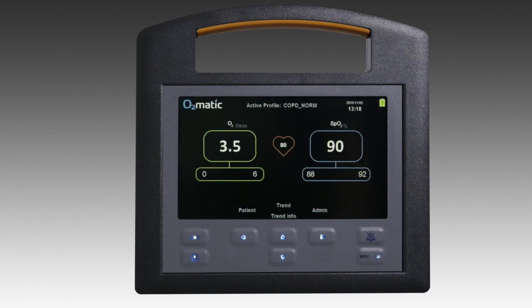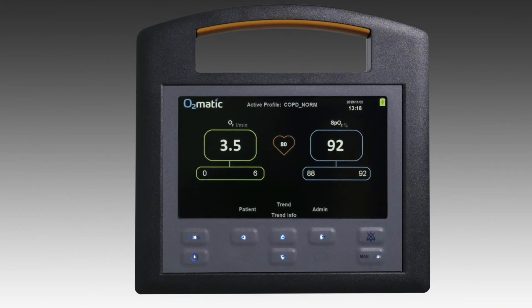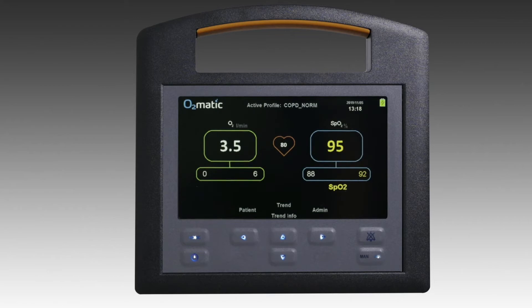On startup, the O2Matic will deliver oxygen against the last profile selected. Oxygen will be delivered to the patient between these flow rates and adjusted depending on their SpO2 measured via pulse oximetry.